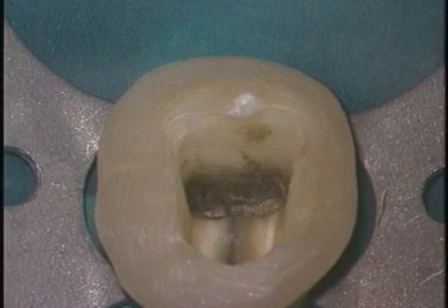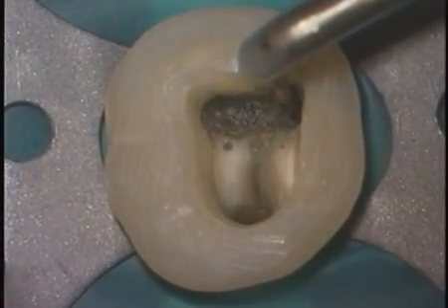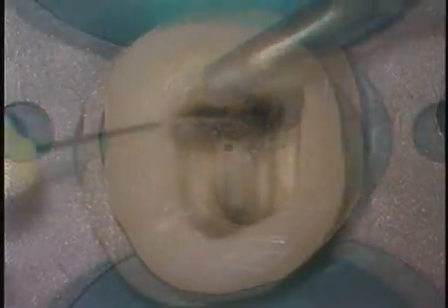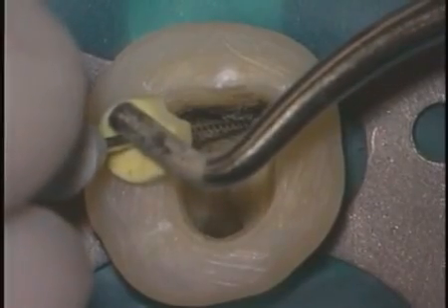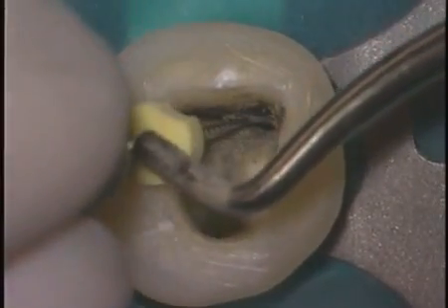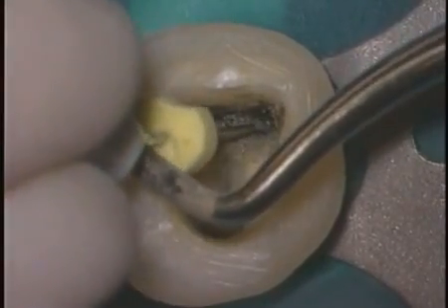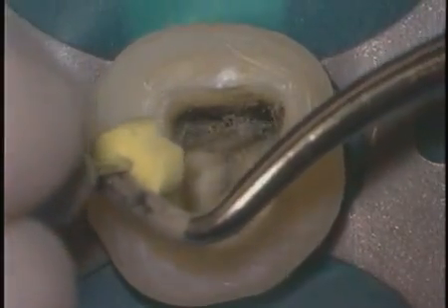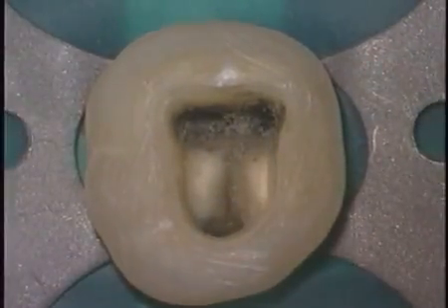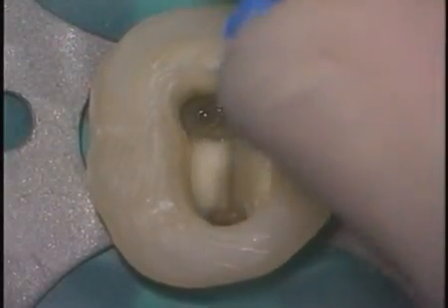We don't really pack MTA like we would pack gutta-percha. We rather just move it gently because we'll position the material precisely with ultrasonics. If you have too much power when using direct ultrasonic techniques, consider placing a 15 or 20 file into the mud and using indirect ultrasonic techniques on the shank side of the instrument. This will create a gentle wave-like action, and the material will adapt nicely to the intaglio of the canals.